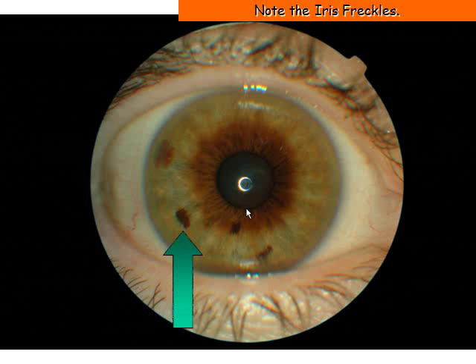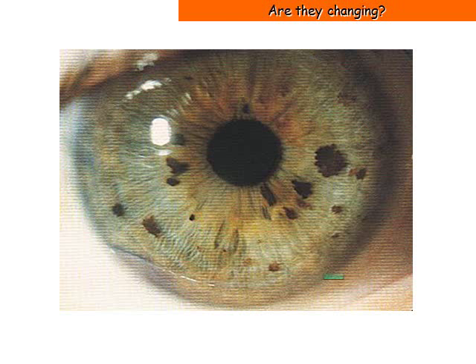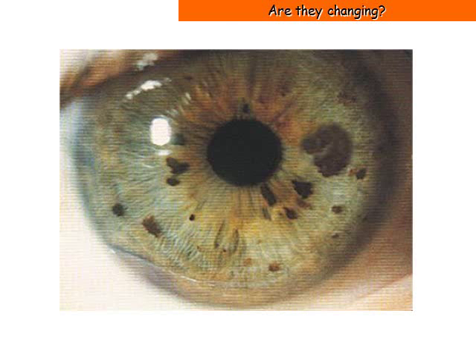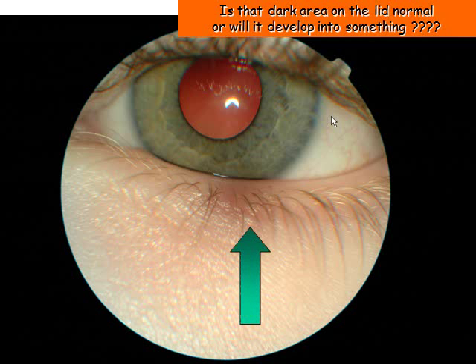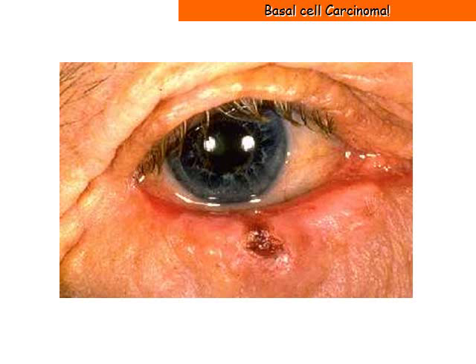In this image, note the iris freckles. Are they changing? Is that dark area on the lid normal or will it develop into something? From the image previously shown, this could be the dark spot on the eyelid.